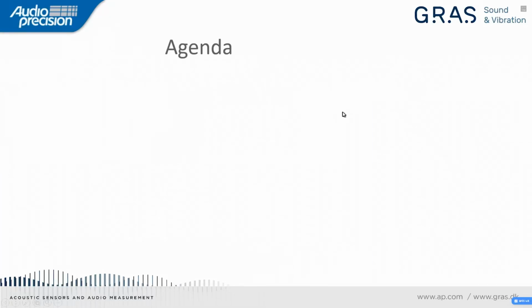All right, so we have a lot of material to cover today. I'll just launch right into it. The agenda we're going to follow here is first, a very brief introduction of an overview of hearing aids. I just want to be the first to say that I have a lot of expertise in audio analyzers, but very little expertise in hearing aids. So I'm by no means an expert, and if that's what you're expecting, I'm sorry, but you may be disappointed.